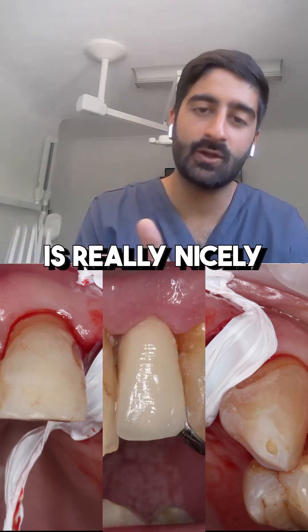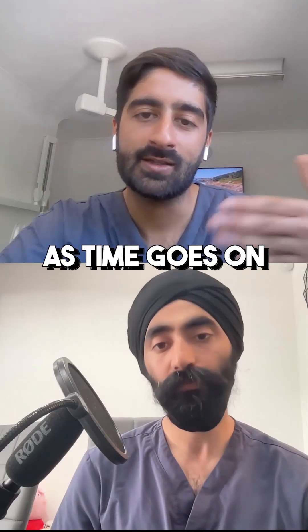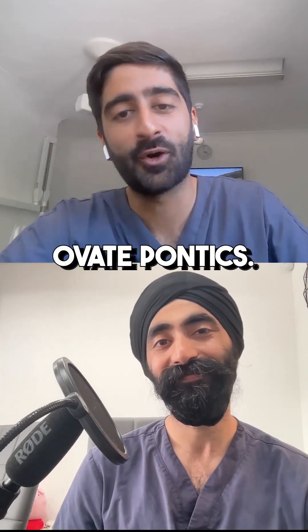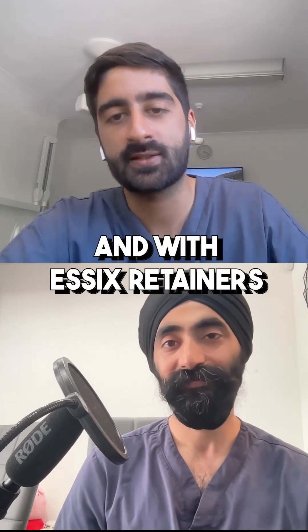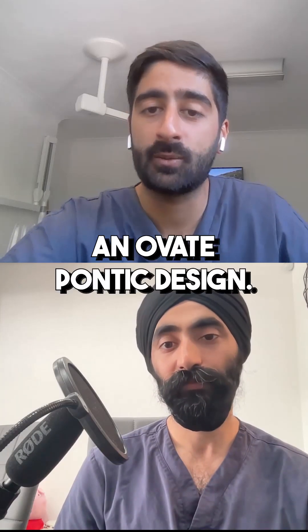I fit it and then the soft tissues really nicely hug around that, and you get a really nice natural emergence profile. As time goes on and patients are becoming more aesthetically concerned, I'm finding I'm going to more and more ovate pontics — doing a lot more soft tissue shaping with Essex retainers or dentures to create an ideal emergence profile.